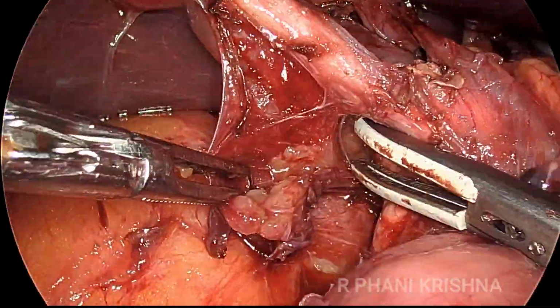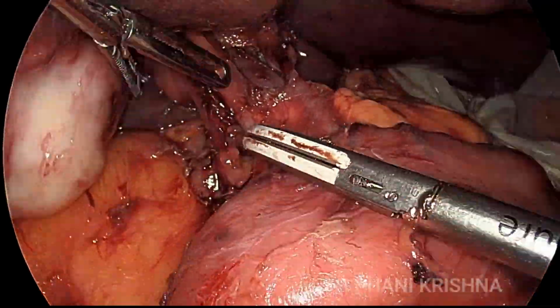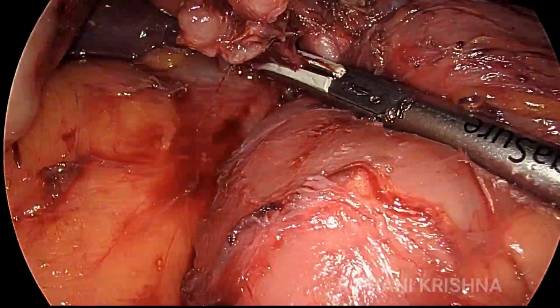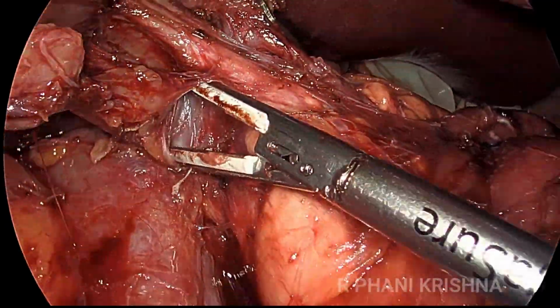progressively go on to the retroportal lymph nodal tissue on the right side. So for this, the assistant holding the junction of the neck and the cystic duct of the gallbladder and flipping the cystic duct medially is extremely useful.